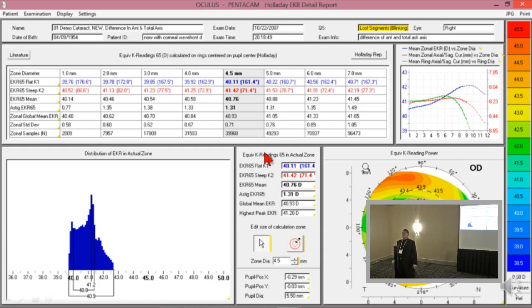All right, but when he looks at distance, that image is out of focus on the retina, and the paracentral cornea is what's used for his vision. So we do that. We calculate, look at those areas and figure out what it is. But anyway, whenever you see something like this that doesn't have a sharp peak, you know that your lens calculation is going to be a little bit suspect simply because the guy's got a bifocal cornea. But he never looks through the average power.